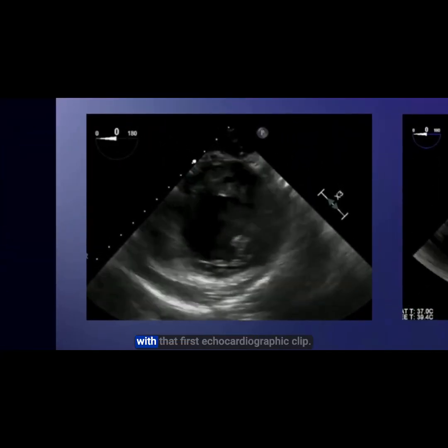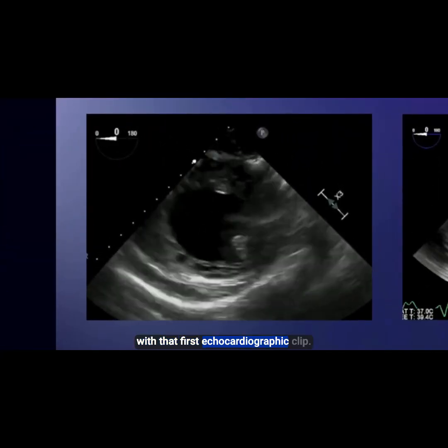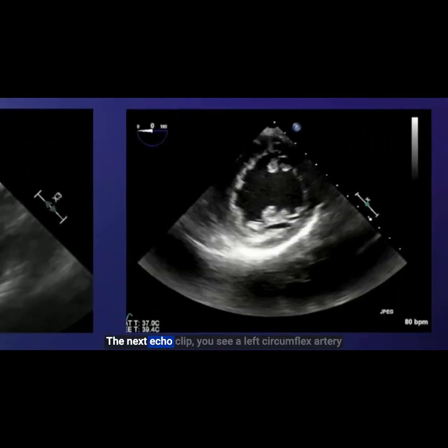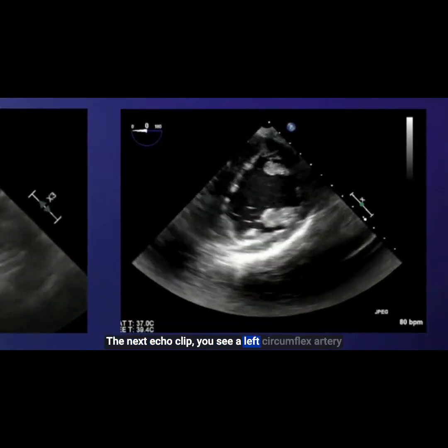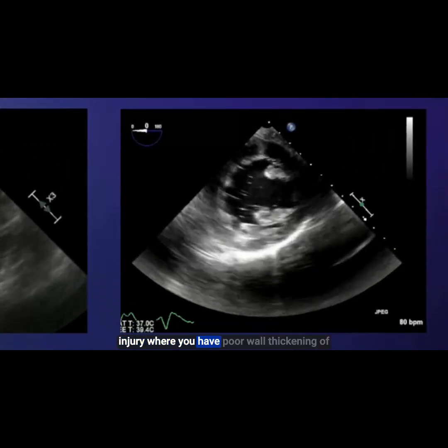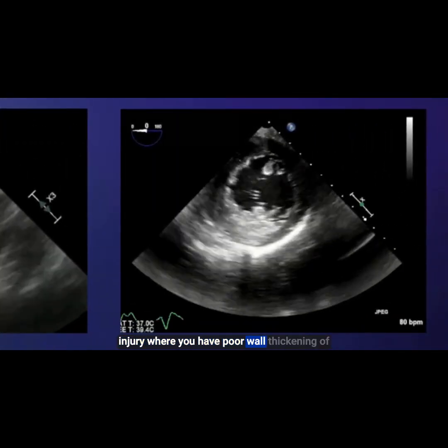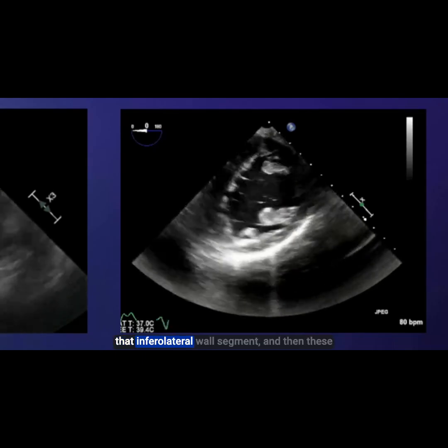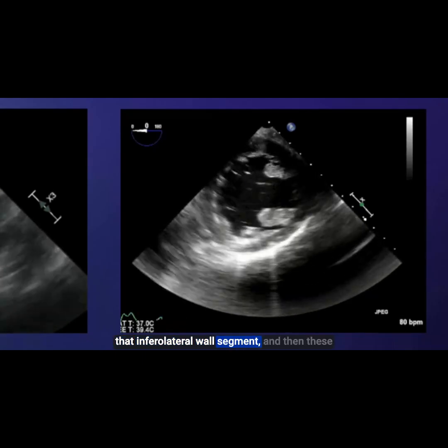You can see a hypokinetic anterior wall with that first echocardiographic clip. In the next echoclip, you see a left circumflex artery injury where you have poor wall thickening of that inferolateral wall segment.